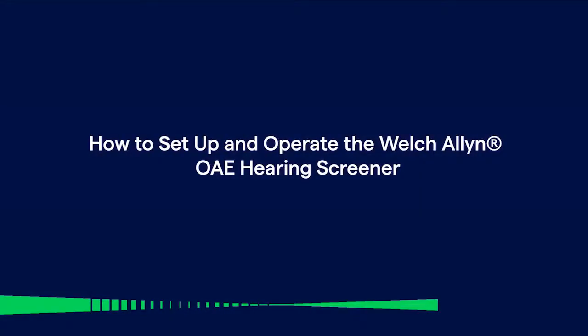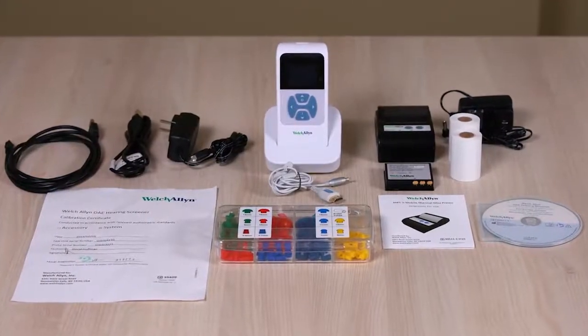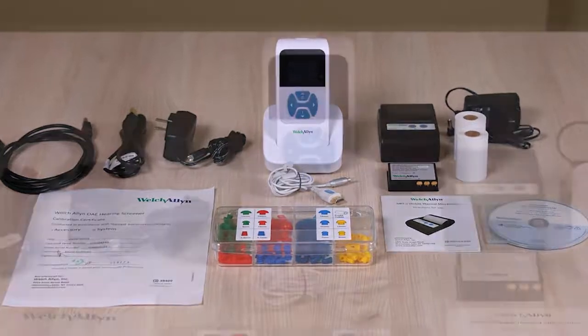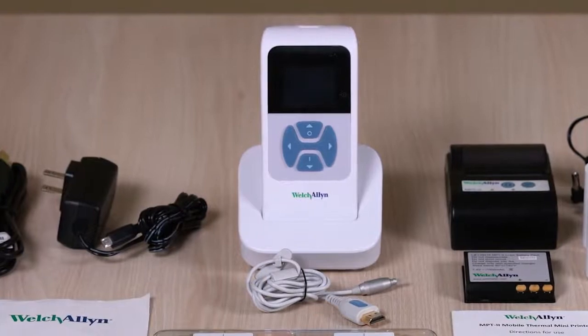Today we'll be reviewing how to set up and operate the Welch Allyn OAE hearing screener. The Welch Allen OAE hearing screener measures otoacoustic emissions, or OAEs, testing cochlear function in infants, children, and adults.